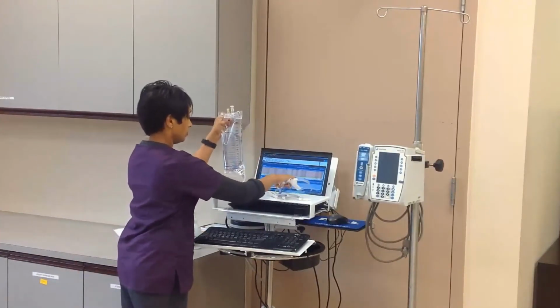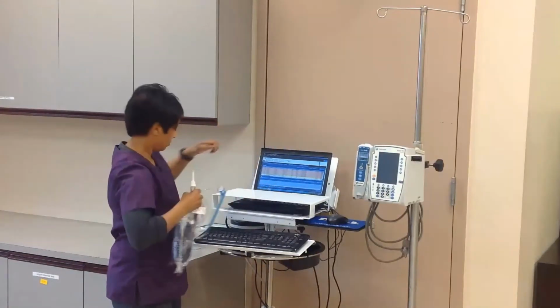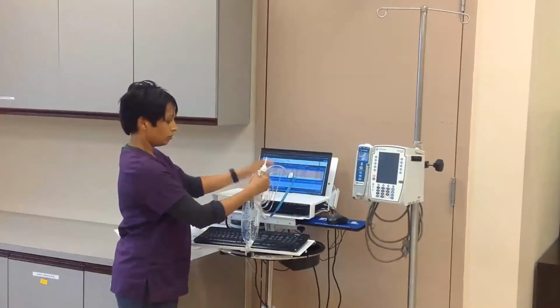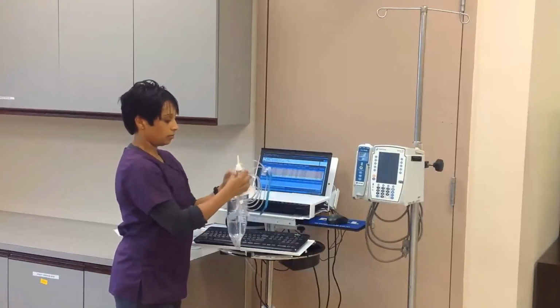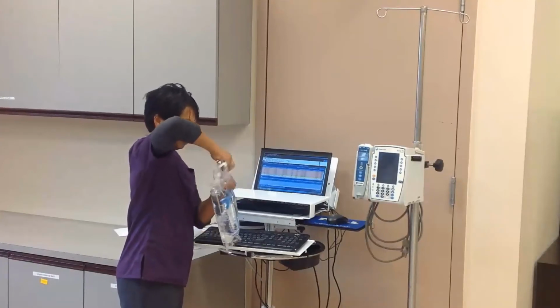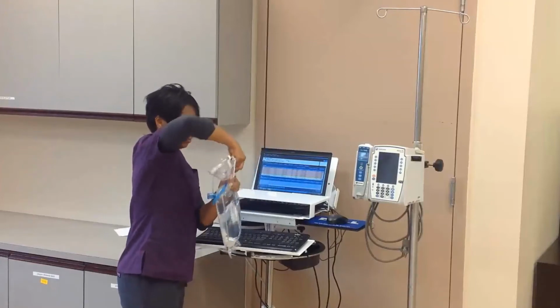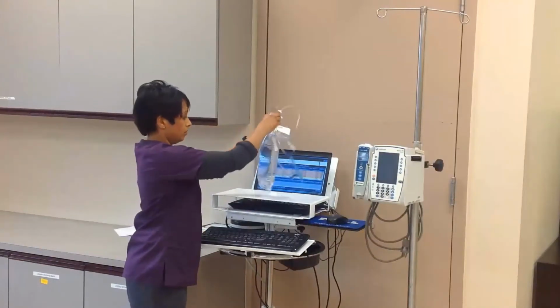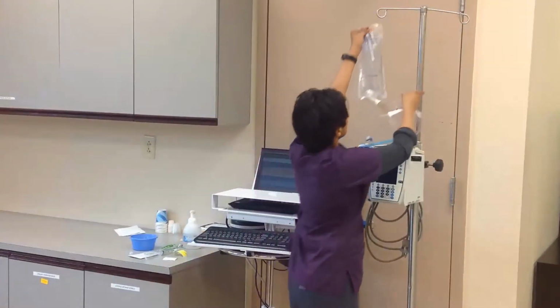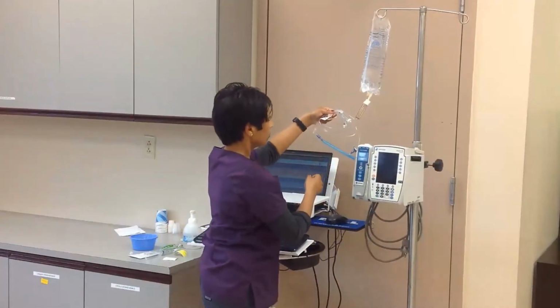Invert the IV fluid bag, holding it at the top where there is no fluid, and remove the plug. Now remove the cap from the spike end and spike the bag. Continue to push the spike until it reaches the fluid. You may now hang the IV bag on a pole or hook while holding the tubing in your hand, again not allowing the access end to fall below your waist.